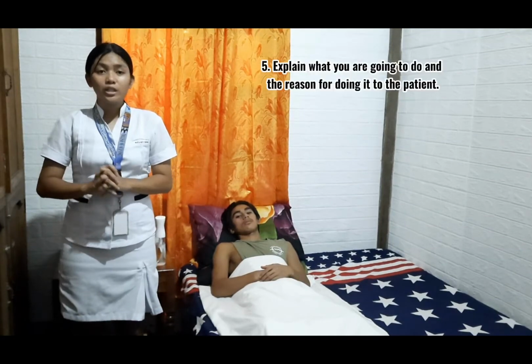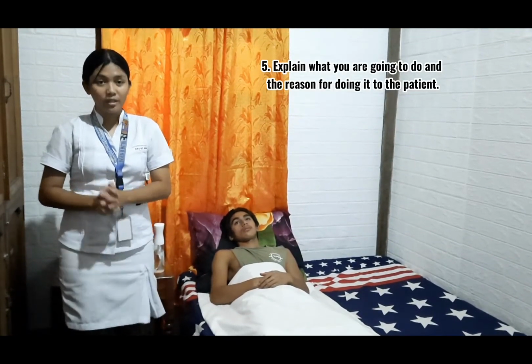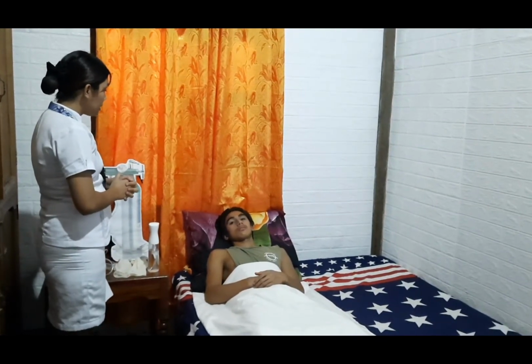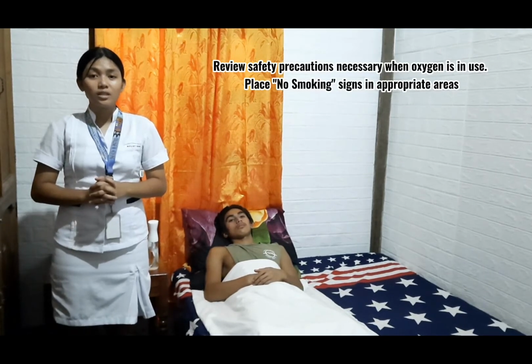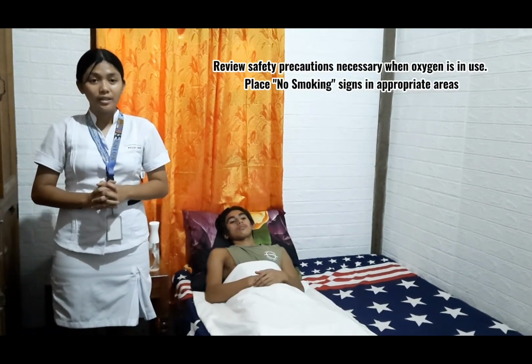Number 5, we need to explain what you are going to do and the reason for doing it to the patient. Sir, I'm going to perform attaching the nasal cannula to help you breathe easier. We need to review safety precautions necessary when oxygen is in use and place no smoking signs in appropriate areas.